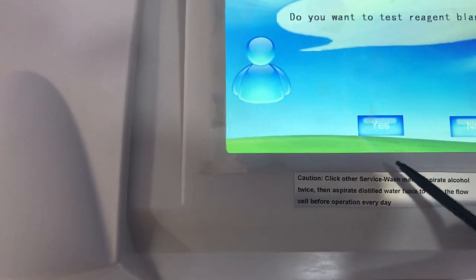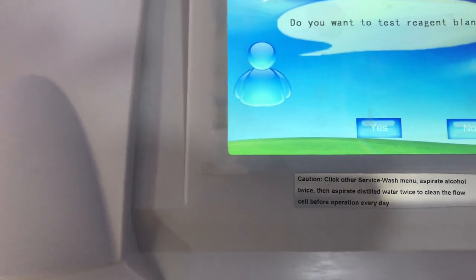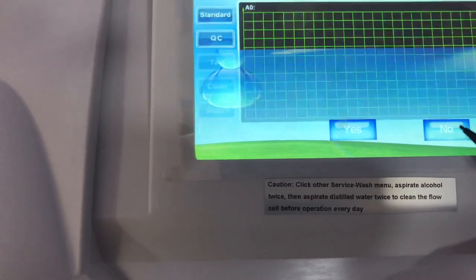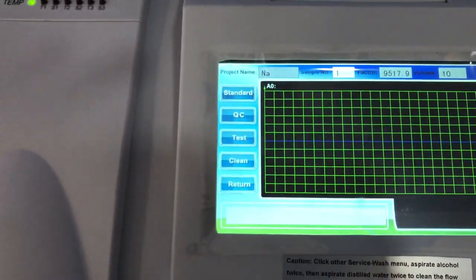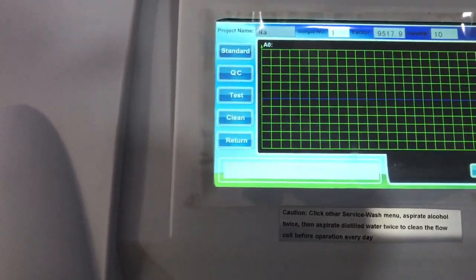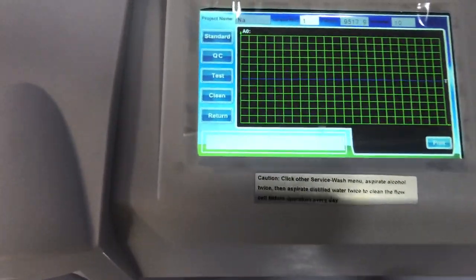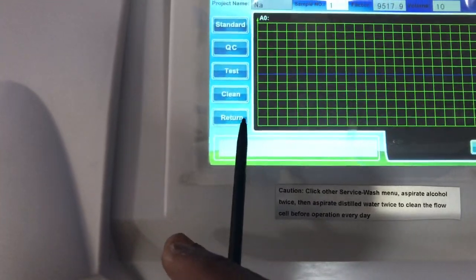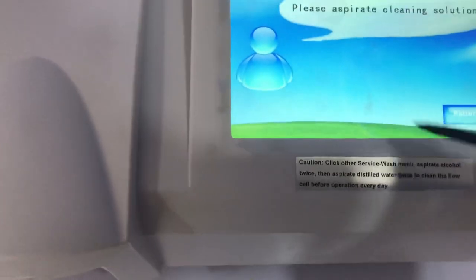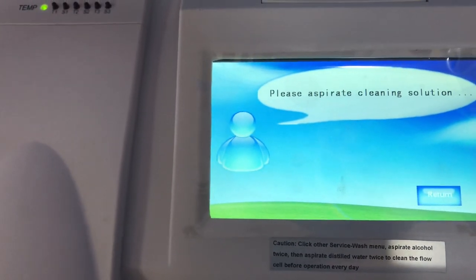When you choose a particular test — let's say sodium — click confirm, and it asks whether you want to do a reagent blank. In this case we are not doing the full test, so I'll click no. It takes me to the interface where you would actually perform the test, but in this video we won't do that — that's for part three. So I'll return, and it asks if you want to wash. Always select yes, as washing is very important.